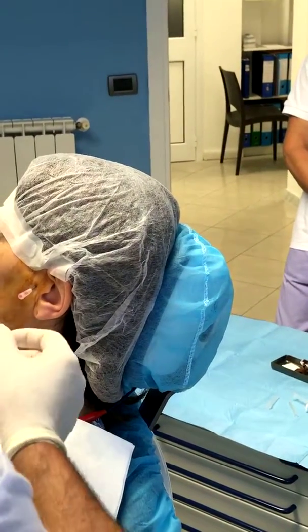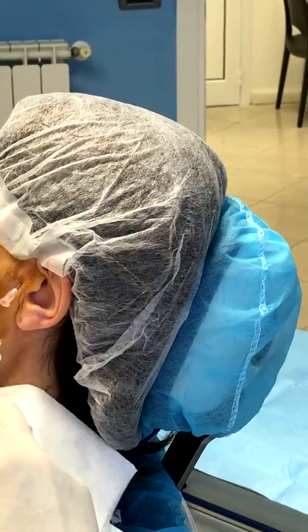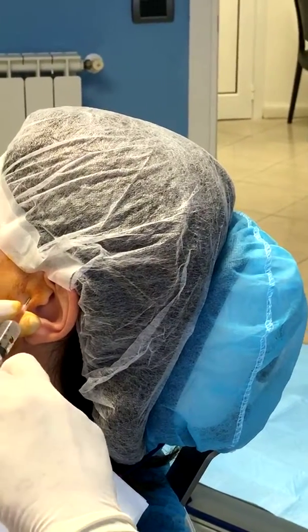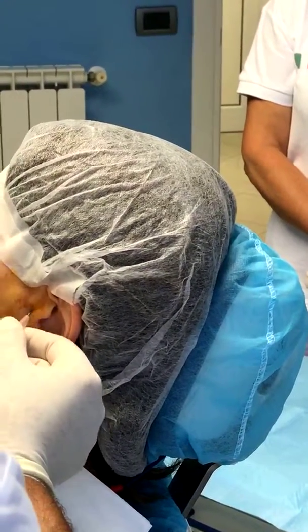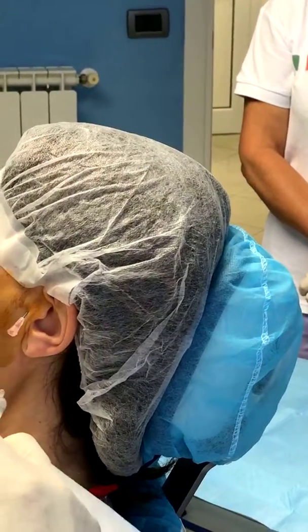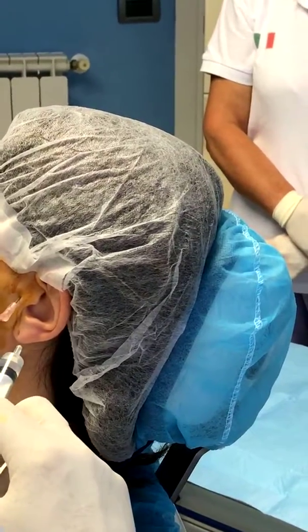Asking the patient repeatedly to close and open — chiuda, apre — while working the needle. The patient is going to feel a pressure in the ear area, but you just advise them of this beforehand. Is it coming out now? Continue with the open-close movements.